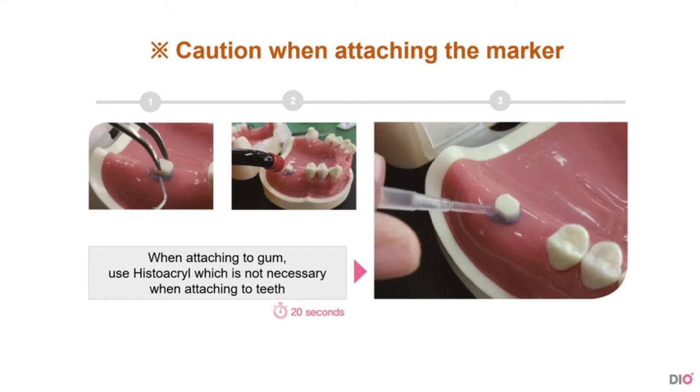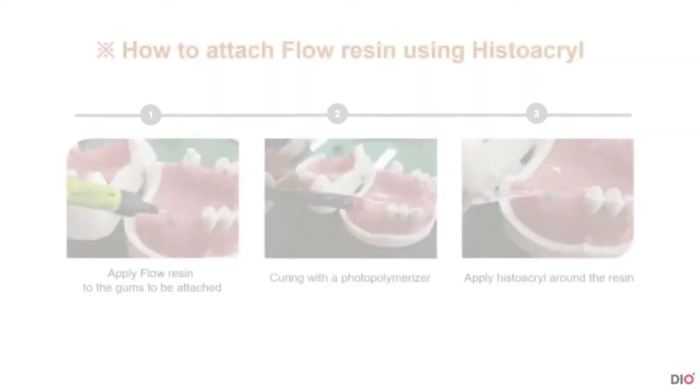Also, you must know that histoacryl is not required when attaching markers to the tooth. However, it is needed when attaching them to the gum. And you have to cure it for 20 seconds. Let's see in more detail in the next page.